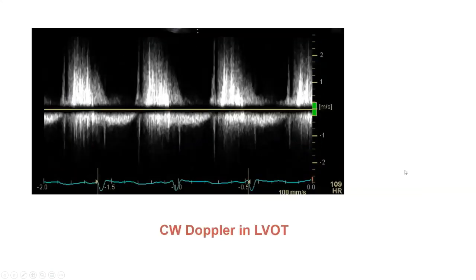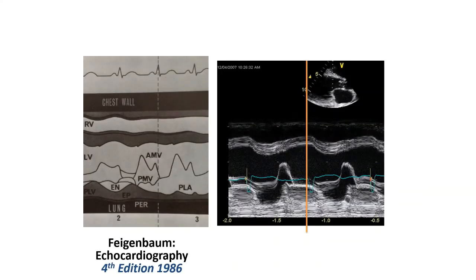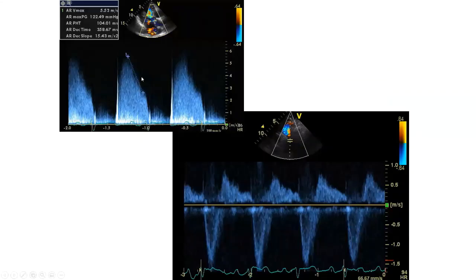Something to look out for is early closure of the mitral valve. Normally the mitral valve closes around the R-wave; in this example, it has closed much earlier. This so-called early closure of the mitral valve is indicative of acute severe aortic regurgitation, most often in someone with staph endocarditis of the aortic valve. Here's another example of a very rapid — we joke and call it the 'slopacious' — aortic regurgitation jet in somebody with bacterial endocarditis.